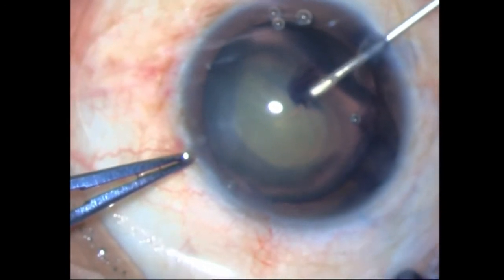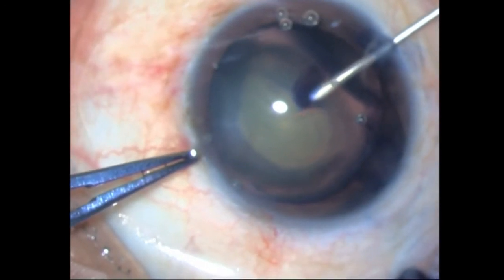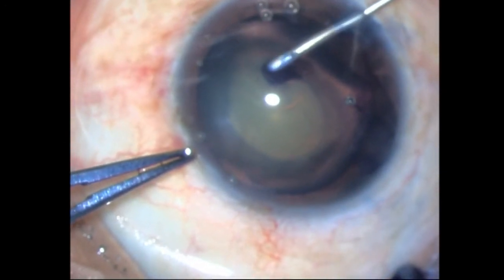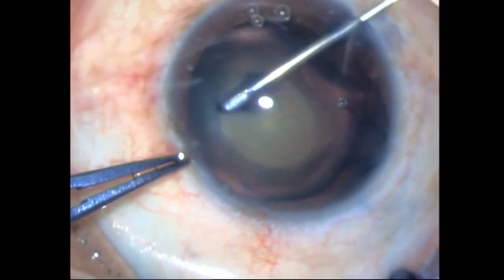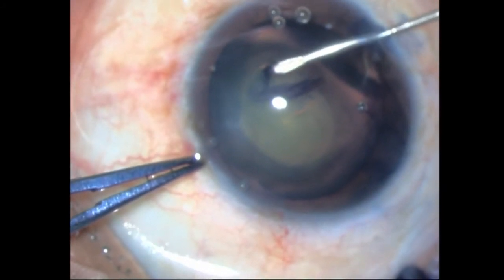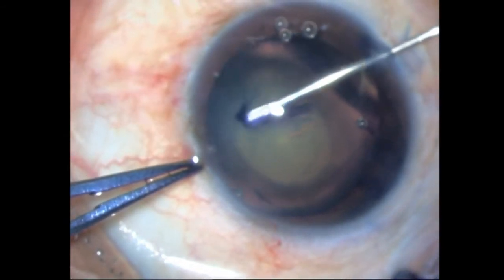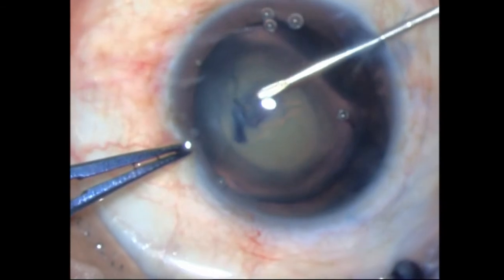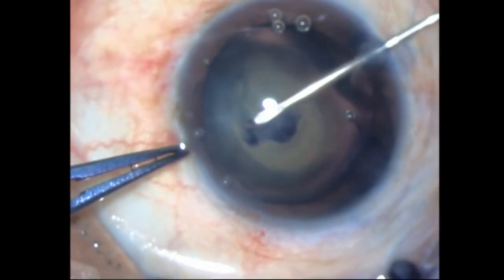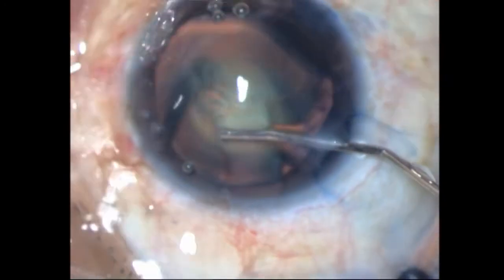I'm not straying too far from the capsular edge, guiding it millimeter by millimeter. It would probably be easier with the utrata or a capsulorrhexis forceps, however I seem to be able to manage with this, so I carry on — and there, that's done. Once I have finished the rhexis, it's time for hydrodissection, and you can see that beautiful wave going across.